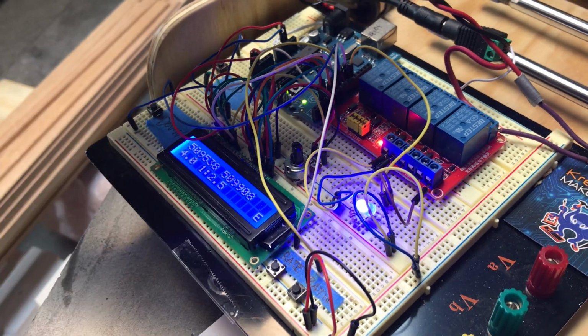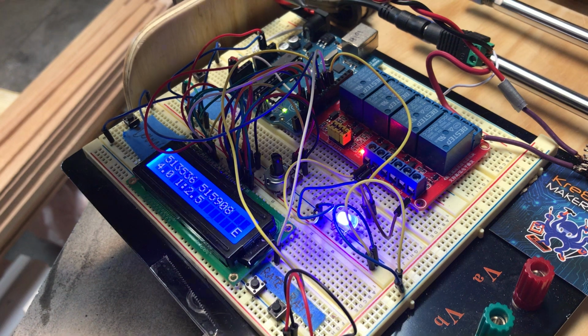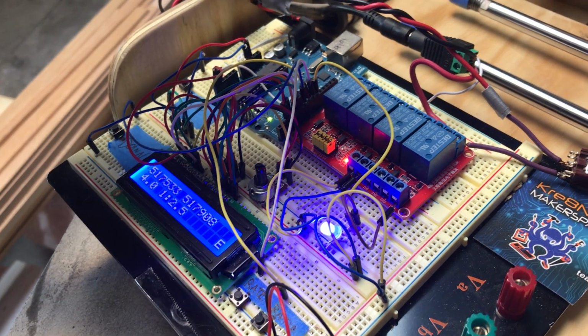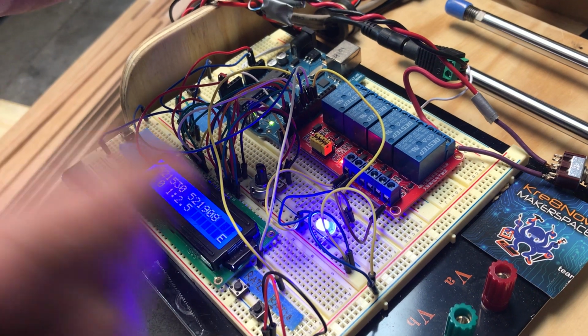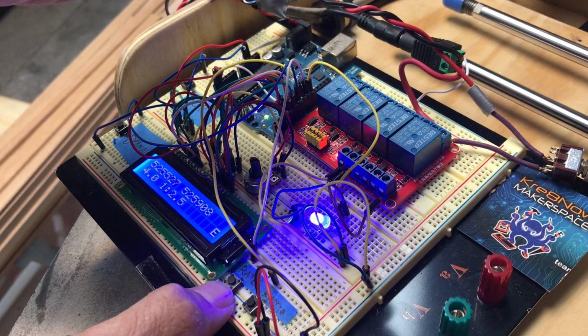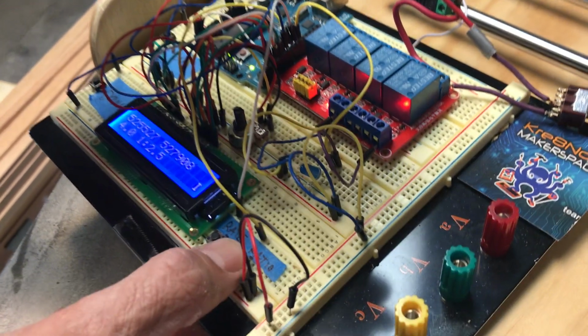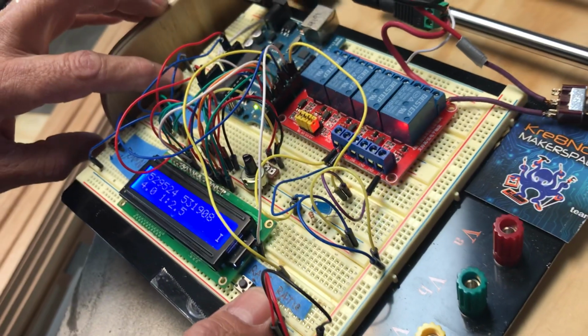And those are the two parameters that the hospital folks speak of, and that's how they codify ventilation. So these are direct inputs into the Arduino. We have rate and ratio here, and this requires two hands to actually adjust it.